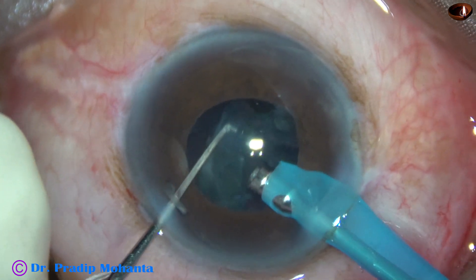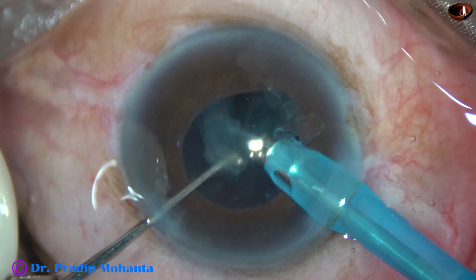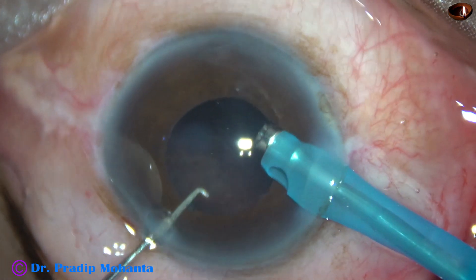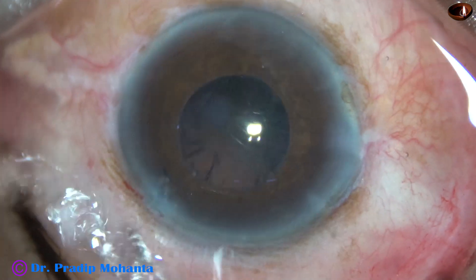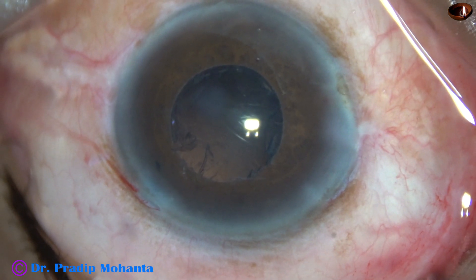The posterior capsule is still protected by a cushion of epinucleus, and this is the cushion. I have to be very careful now — I must not catch the posterior capsule. And I didn't. So it was a very patient surgery, slow and patient.